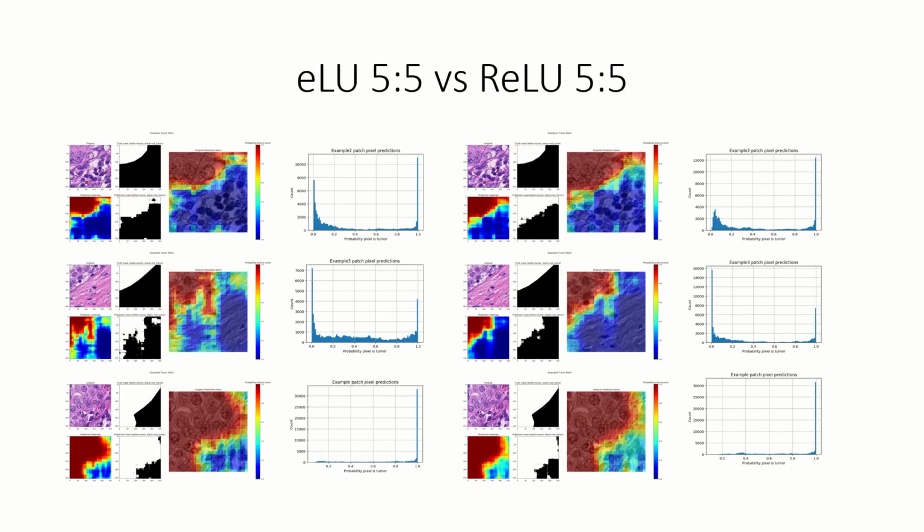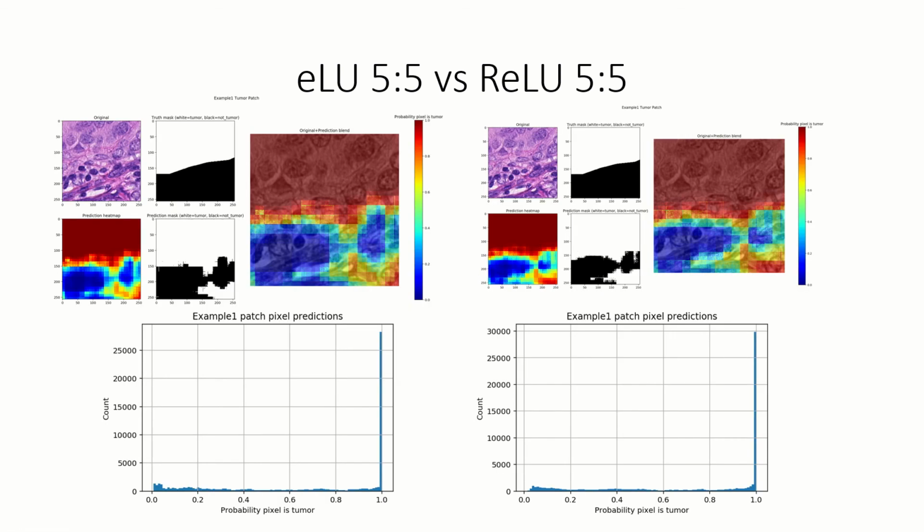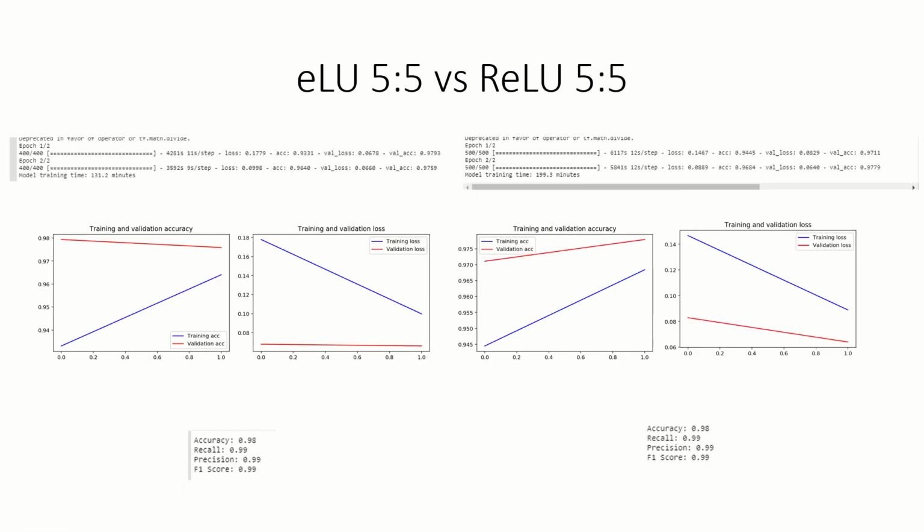So in my case, you can reach accuracies of 97.8% and 97.6%, which is almost the same, just using the shortened version of VGG16 instead of transfer learning. And that is the final result I got for the project.